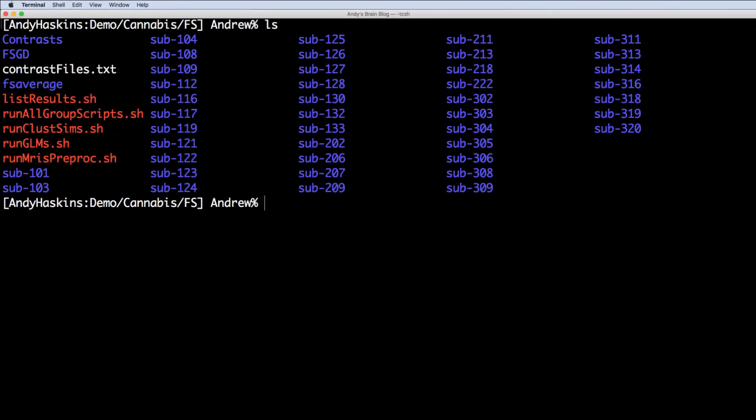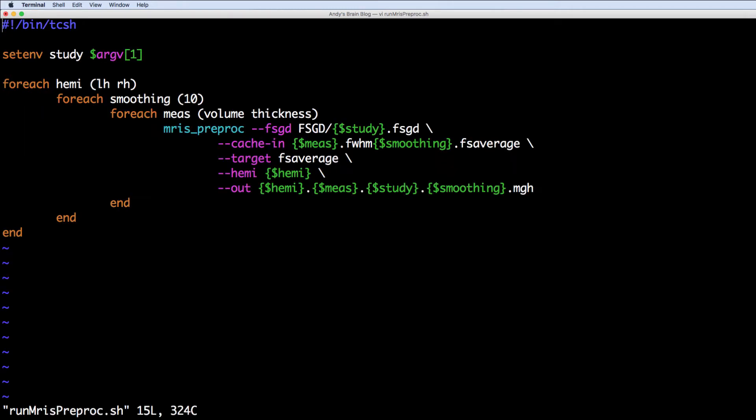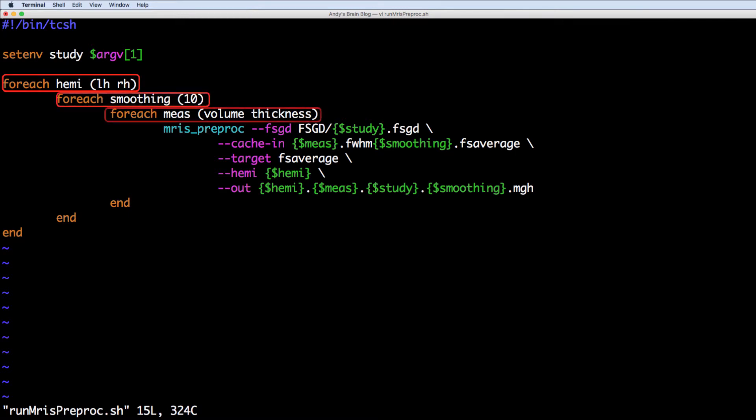Our first command is mri's preproc. This concatenates all of the subject maps that we will use for our group analysis. I've created a script that gives you control of looping over hemispheres, smoothing kernels, and measurements.